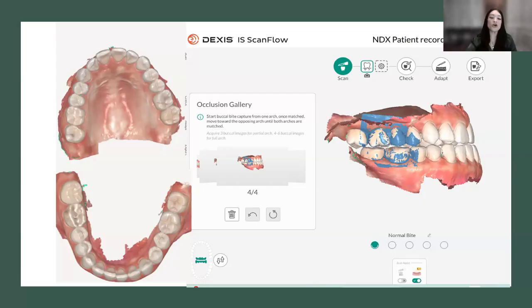When I go to the lower arch, I do something totally opposite. I collect occlusal table. And just a friendly reminder that when we're canine to canine, upper and lower, I'd love a little bit of wiggle buccal lingual to give me about 2 millimeters of buccal lingual on the sides or edges. So then we do build the buccal lingual wall. The scans will be seamless with no arrows to tell us that there's anything missing.